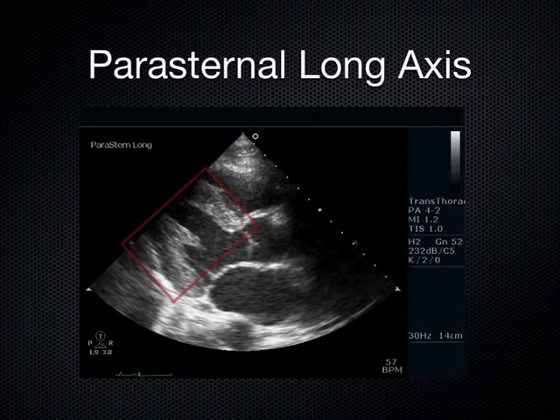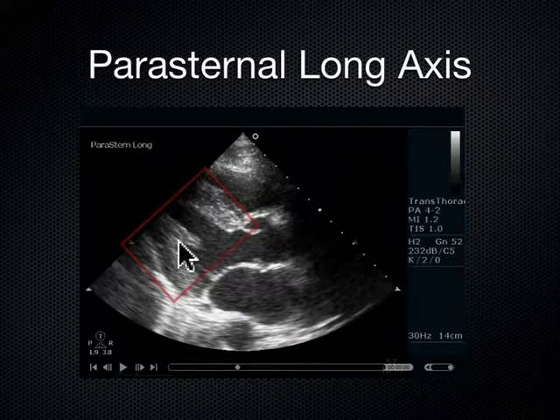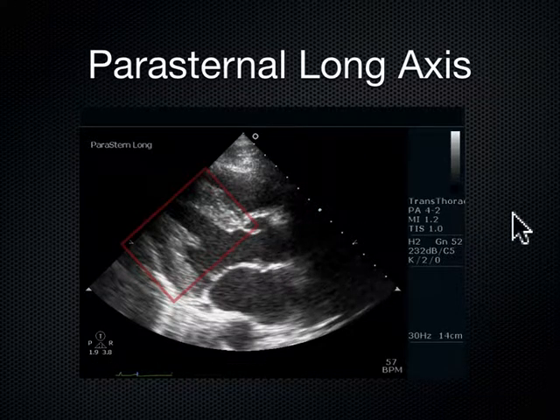Let's call this right here end systole. How do I know that is end systole? Well, the posterior wall and the interventricular septum are close to each other right there, and this aortic outflow tract, that's open. This is the one leaflet of this aortic valve. It's a tricuspid valve. We don't see all the leaflets here. There's one leaflet. We can see it's clearly open, and I'm sort of hallucinating a little bit. Maybe that posterior leaflet down here is also open, and the blood's coming out during systole. And this is that LVOT that you're going to measure as one measurement when we move to the hemodynamics part of things.